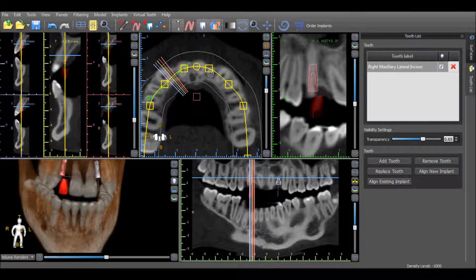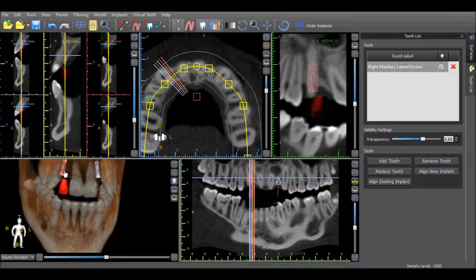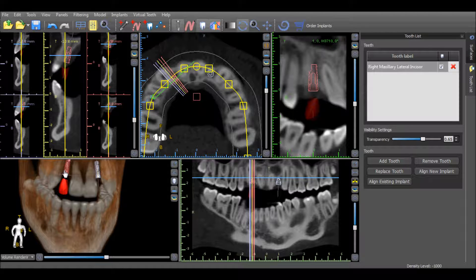If the implant has already been placed and you would like to align it based on the virtual tooth, press the Align Existing Implant option and then select the implant which you would like to align. The software modifies the implant placement to align it based on the virtual tooth.